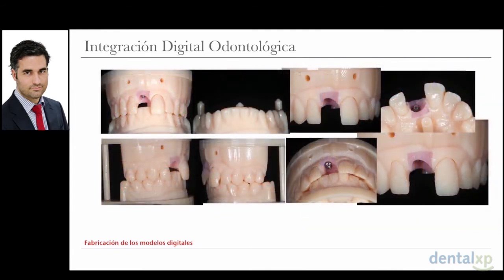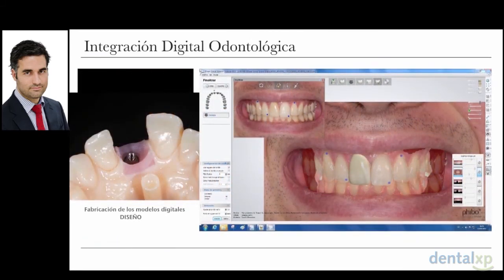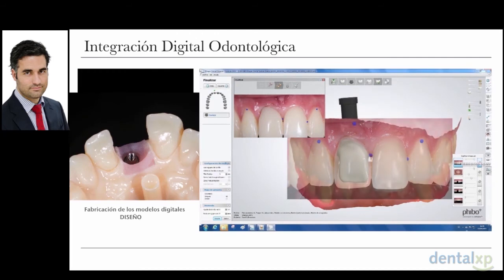As you can see, here is a definitive cast, and the lab starts designing our abutment based on the photographs, the pictures that I sent to the lab.